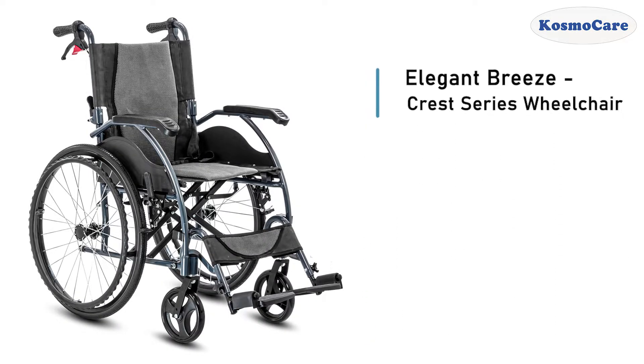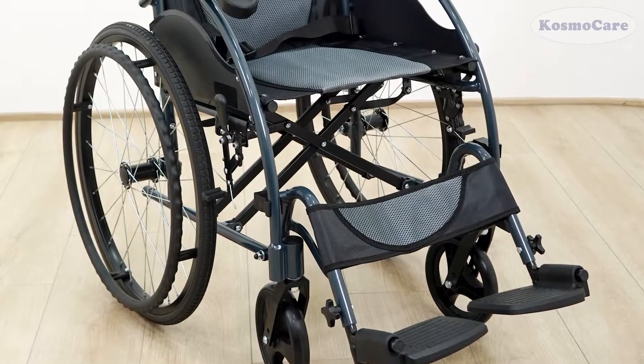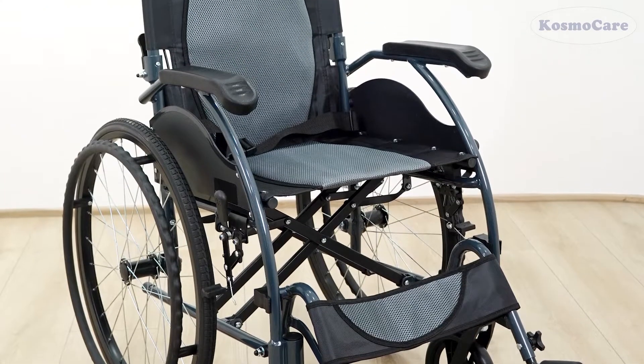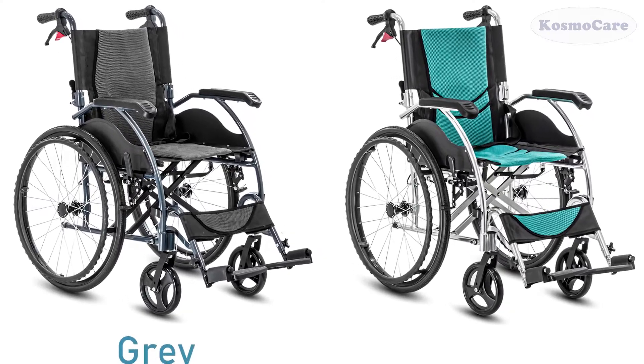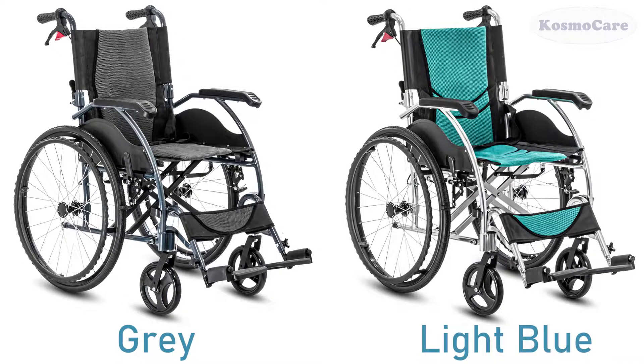CosmoCare Elegant Breeze Crest Series Wheelchair offers a durable and dependable mobility solution to users to support independent living. It is available in two attractive color options: gray and light blue.